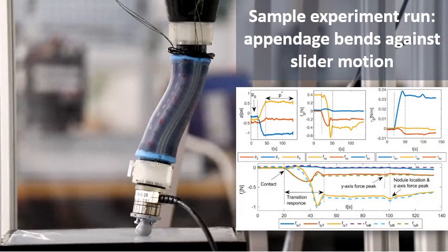Here are sample experimental results. We can identify the contact of the appendage with the tissue based on the variation of the internal pressure and the values the force sensor shows. Also, we can identify the stiff region based on the variation in the horizontal and vertical force values. You see the solid line, the estimation based on the base force reading, and the dashed line, the exact values based on the tip force sensor, showing good agreement.